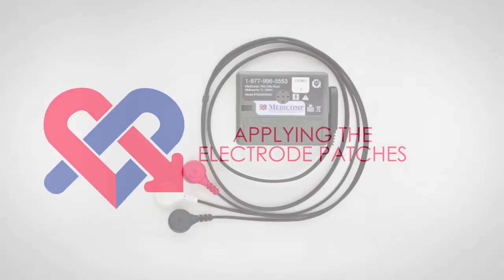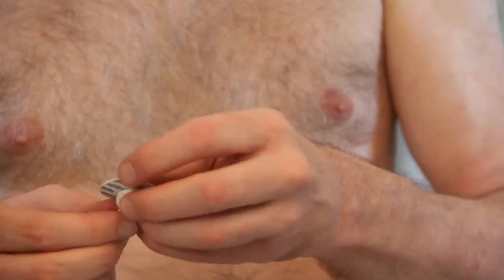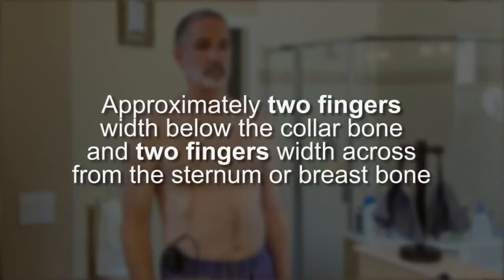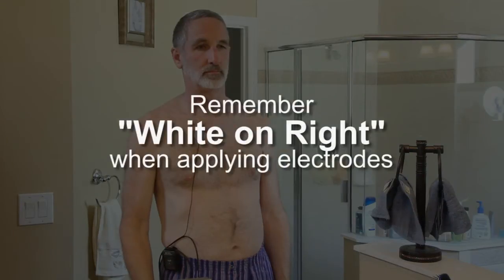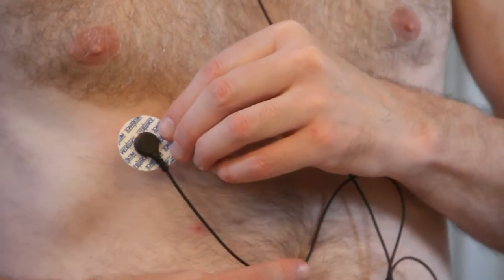Applying the electrode patches. Find the patient cable. First, take the wire with a white terminal. Snap the white wire onto one of the electrode patches. Peel it from the plastic backing and apply it to the upper right area of your chest — approximately two fingers' width below the collar bone and two fingers' width from the sternum or breast bone. Remember: white on right when applying electrodes. Now take the wire with the black terminal and snap it onto one of the electrode patches. Peel it from the plastic backing and apply it to the lower right below the white one. It should be applied over the first rib you feel below the breast in a direct line down from the midpoint of the collar bone.